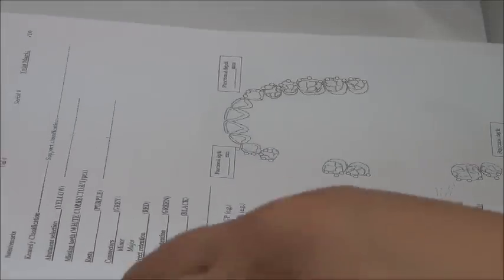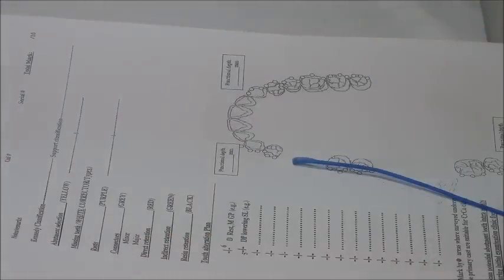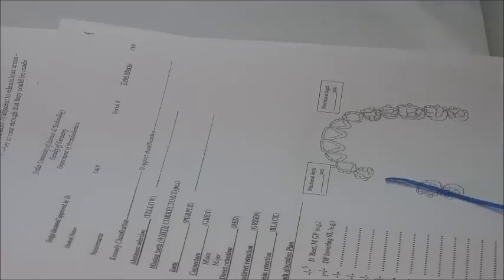The one on the right, page 6, the uppercase. One band and saddle on one side. What do I do here? Okay, a strap rather than the rest, then plate, yes. I change to a strap. I don't need a hole. Or a bar, a palatal bar for example, as the major connector. He changed the major connector.